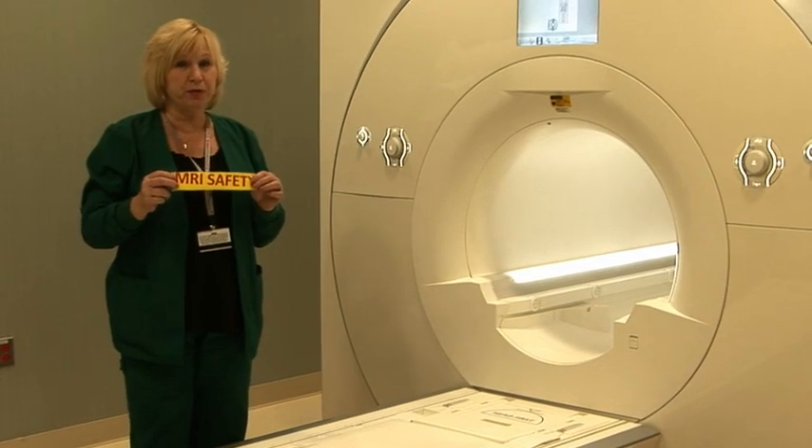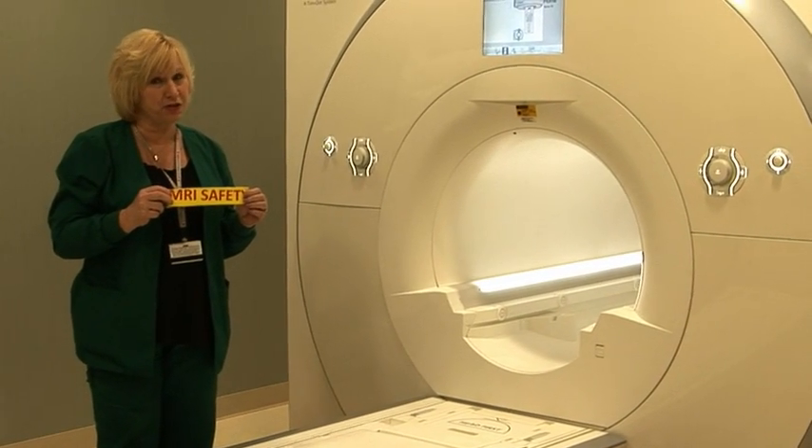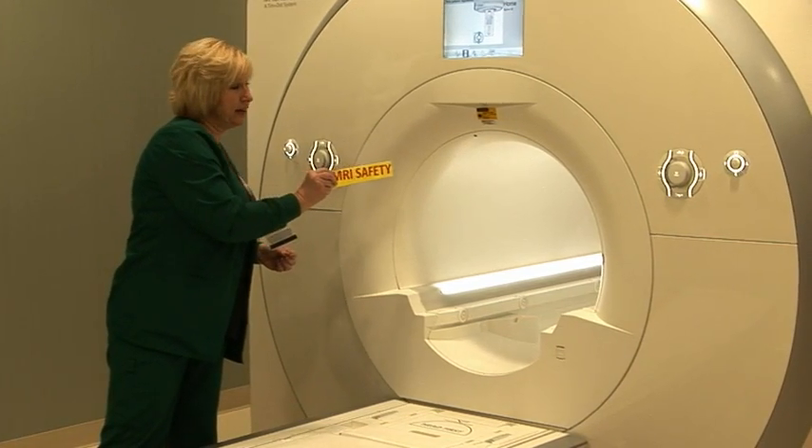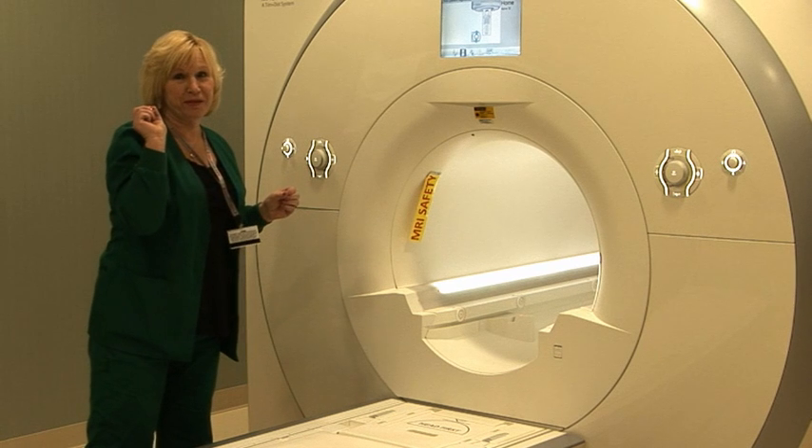As anything, when you walk into the room, the closer to the magnet you get, the stronger the magnet gets. As I get closer to the magnet, it gets stronger, and when I let it go, it snaps it right in.